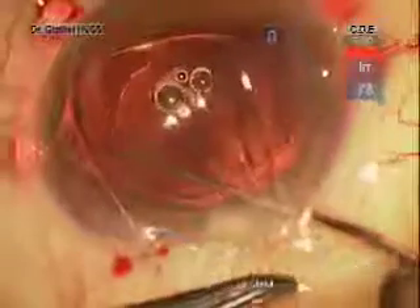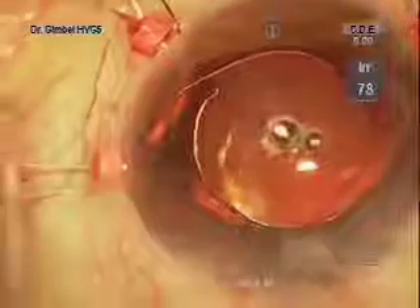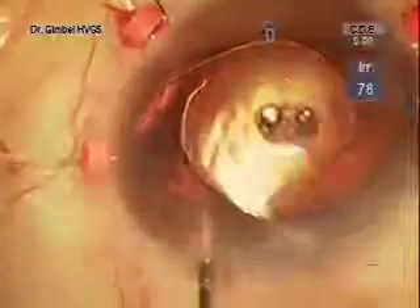I'm trying to rotate it to slip the haptic a little farther along on the knot for ideal centration. Then a placement of the other suture, again through paracentesis, through the membrane under the haptic, and out again. Capturing the end of the needle with a 26-gauge cannula. You can see that we have used iris hooks to get adequate exposure in the area where we are going to do the suturing.